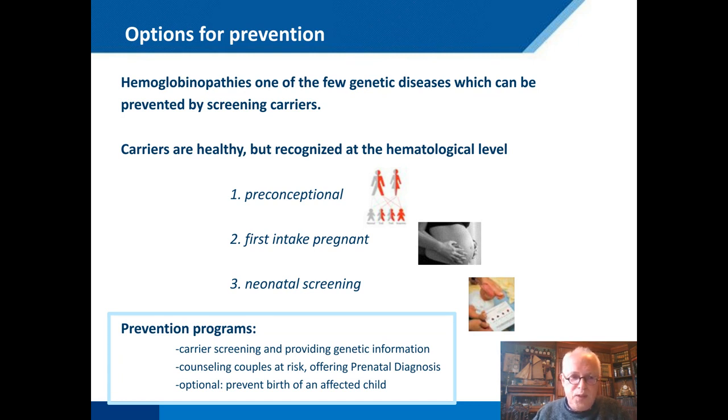And as you probably all know, if you are a little bit, let's say, tired, and you go to your general practitioner, you often get a blood investigation, and the values of that are automatically determined in most laboratories. So every clinical geneticist or clinical chemist can actually see if someone is a carrier of a thalassemia, especially when the iron level is normal.